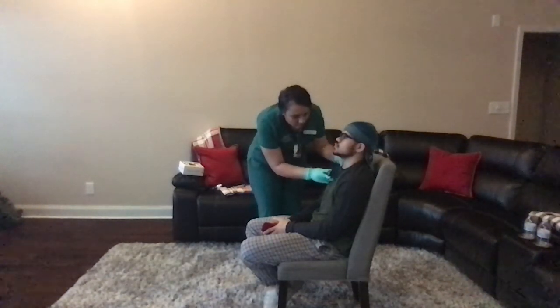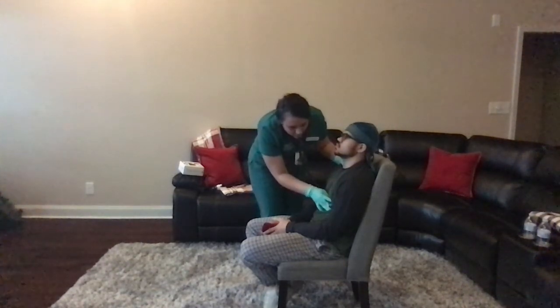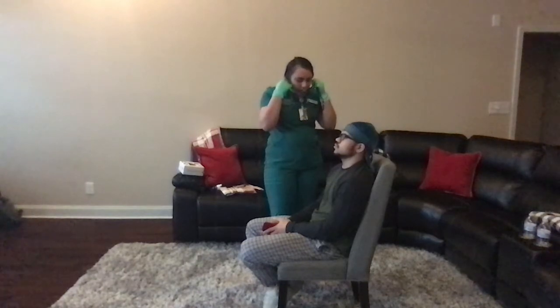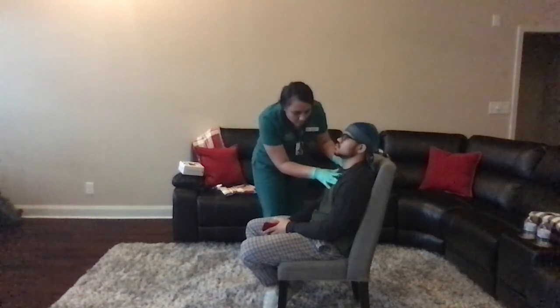Aortic, pulmonic, tricuspid, and mitral. I'm going to make sure that I'm listening at each of those for 10 to 20 seconds, and now I'm going to do 6 points on the front of the chest.